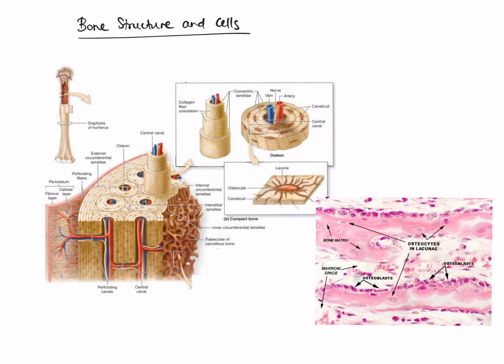So this is a revision slide for you to use, with those images labelled for you on the left, and here on the right a great histological image that's labelled with all the cells that generally sit within bone.